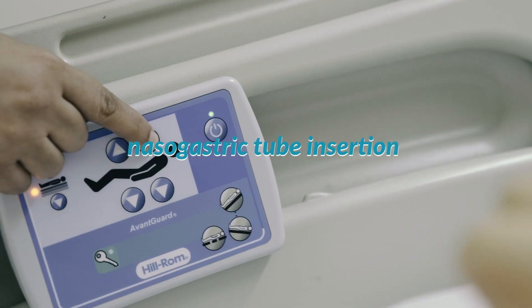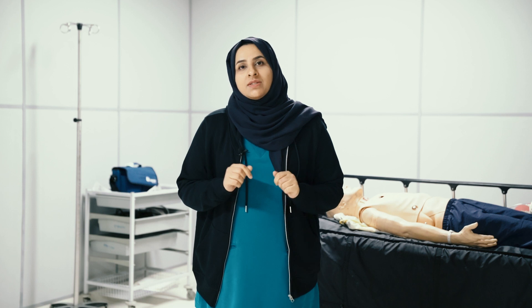Hello everybody, my name is Zainab Al-Farsi. I'm working as a clinical nurse specialist in the gastro department. In this educational video, I'm going to talk about nasogastric tube insertion for an adult patient.